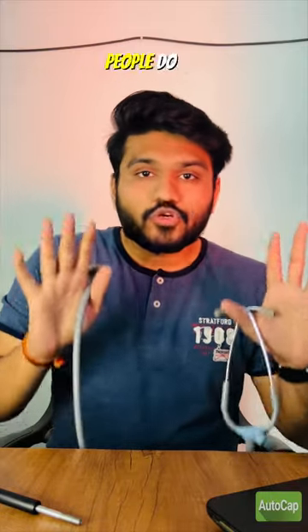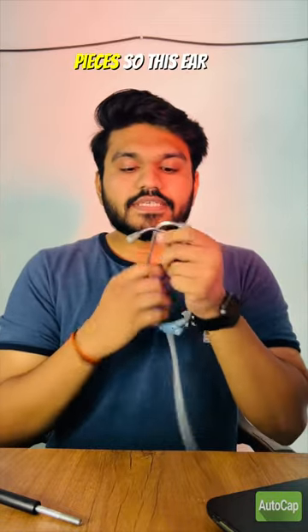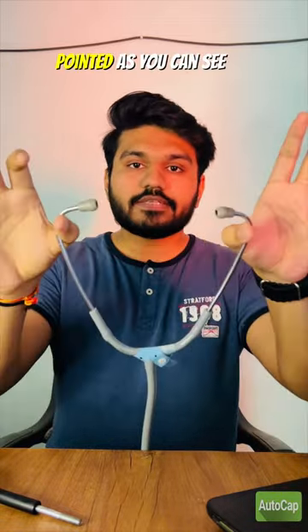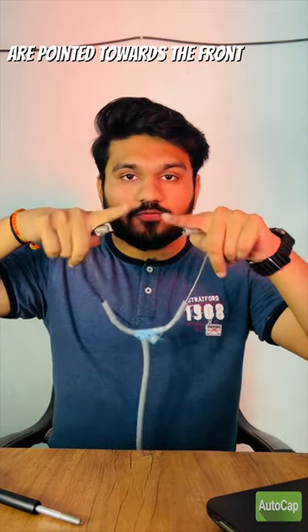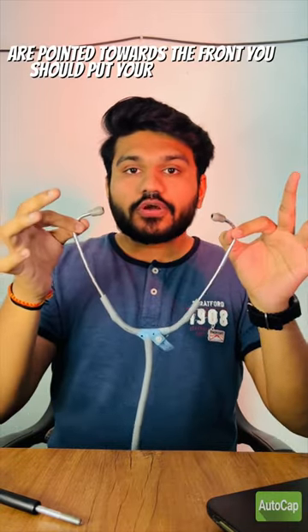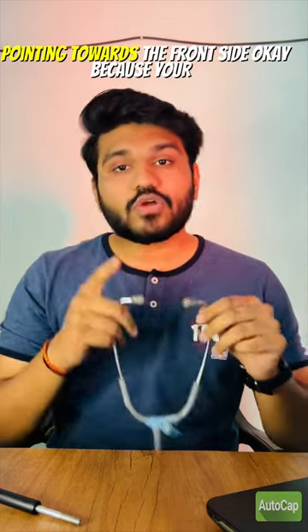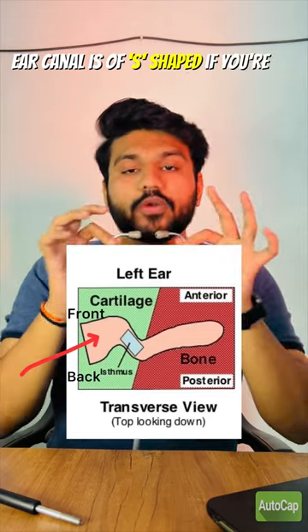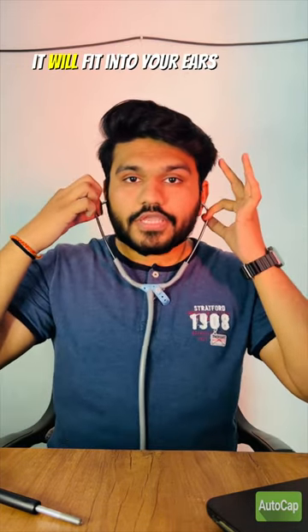Most people make mistakes with the listening part. These are the earpieces, and as you can see, they are pointed toward the front. You should put your stethoscope earpieces pointing towards the front side, because your ear canal is S-shaped. If you point your earpieces towards the front, it will fit into your ears and you will hear heart sounds better.